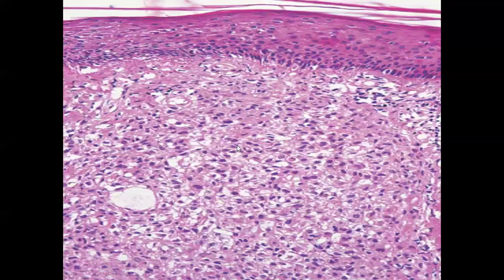On histology, the appearance is diffuse sheets of foamy macrophages. There will not be any well-formed granuloma, but the macrophages are in the form of sheets. And if you do a lepra stain, you would see numerous acid-fast bacilli within these macrophages.